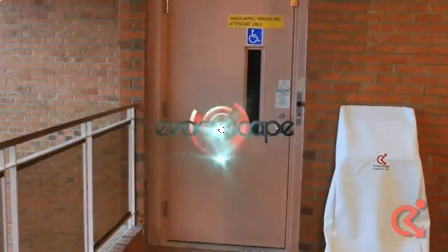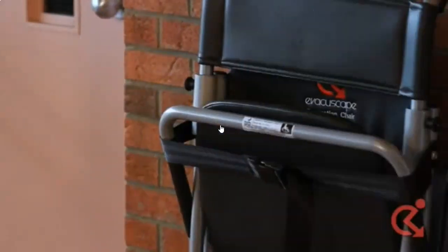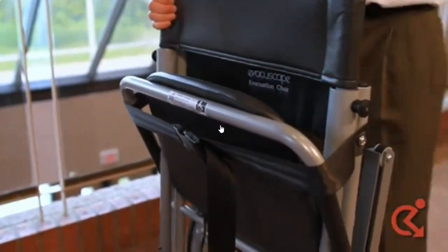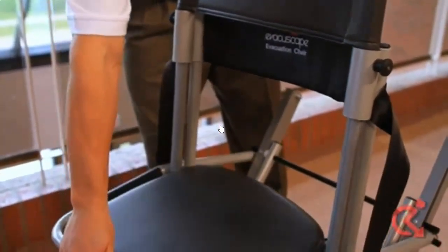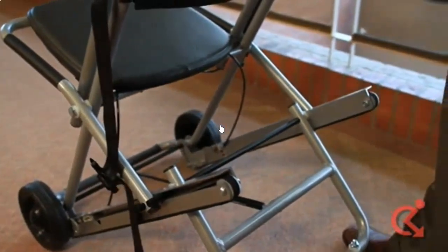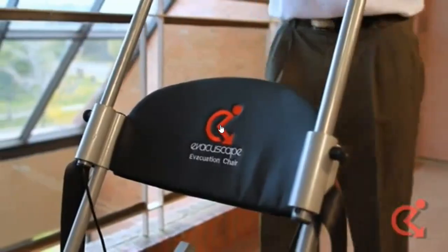In the event of an evacuation, the Evacuscape chair can be deployed using four quick and easy steps. Take off the cover and remove the Evacuscape chair from the wall-mounted bracket or storage position. Undo the seatbelt to lower the seat and track. Push the seat down until it is fully deployed, then pull the rear wheels out until they lock. Pull out the adjustable pins and lift the handle until it locks.